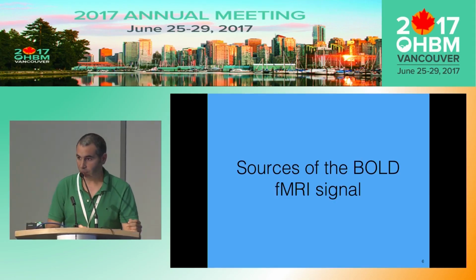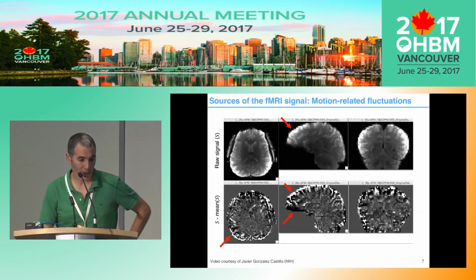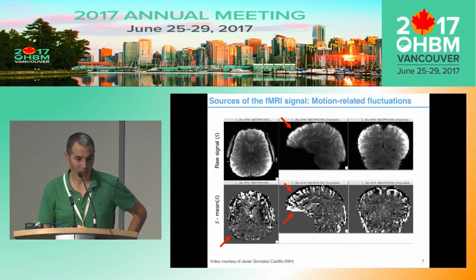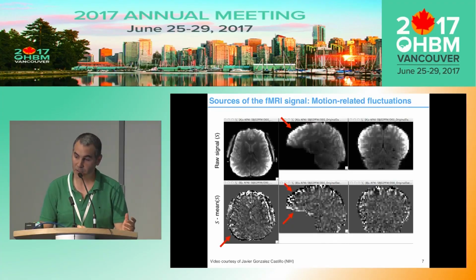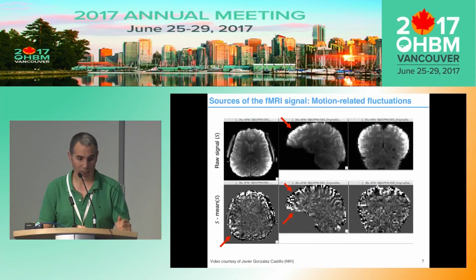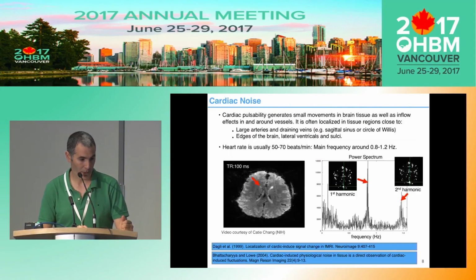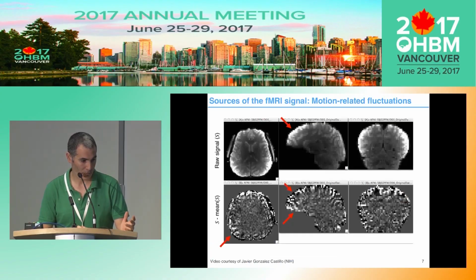So which components are in the fMRI signal? Probably the most important one is the one related to motion. When we collect the images, of course our subjects are moving the head.